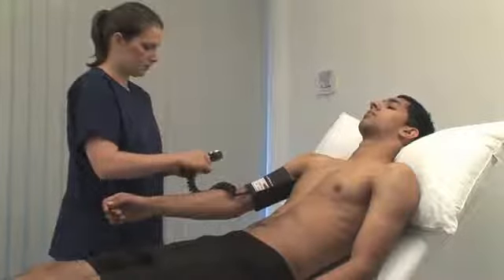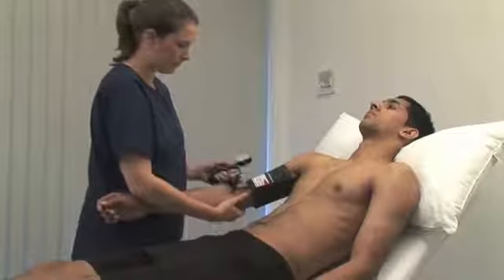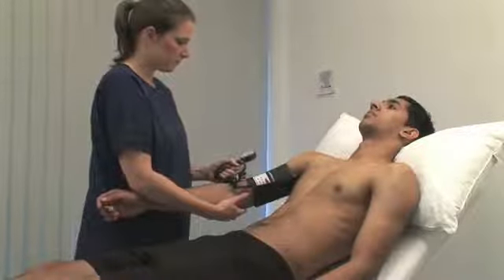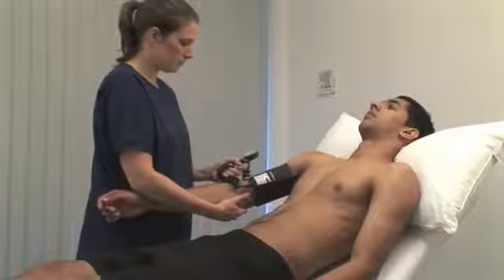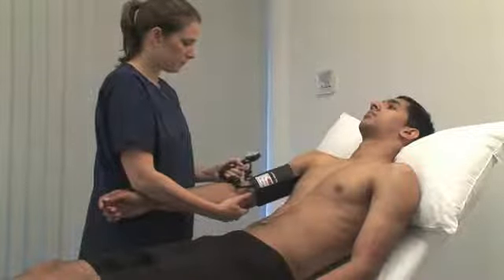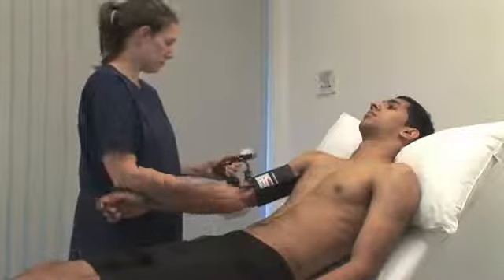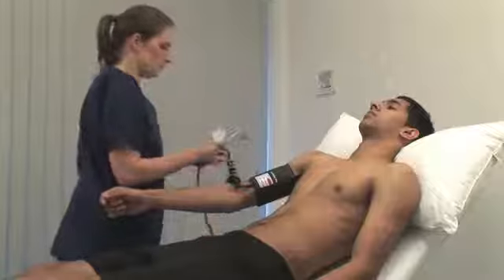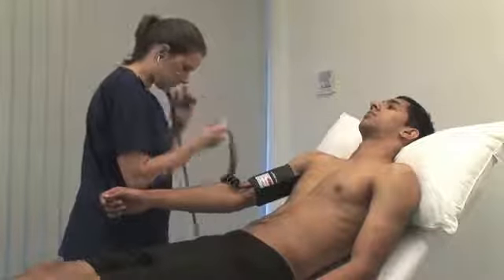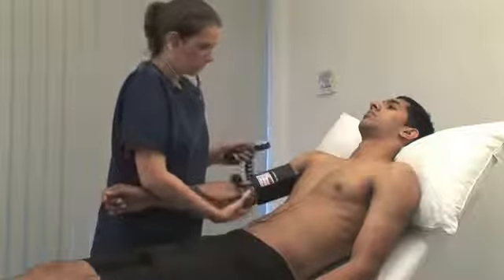The point at which the pulse becomes impalpable is a rough estimate of the systolic pressure. Inflate the cuff by a further 30 millimeters of mercury, then listen over the brachial artery with the stethoscope diaphragm. With the cuff inflated above systolic pressure, you should not hear anything. Slowly reduce the cuff pressure by 2 to 3 millimeters of mercury per second.